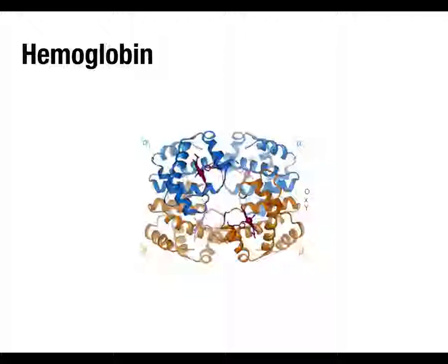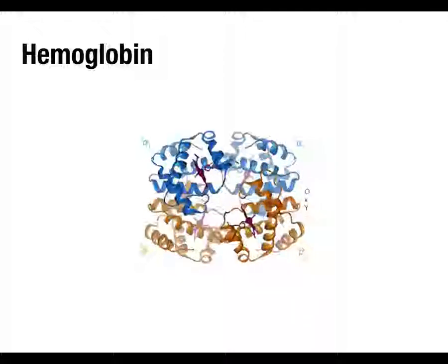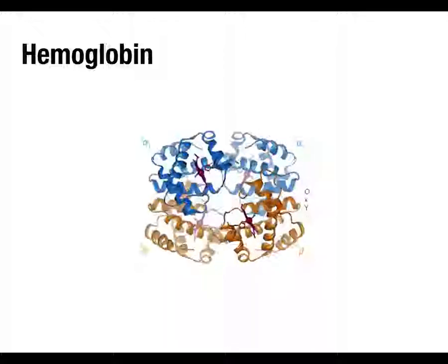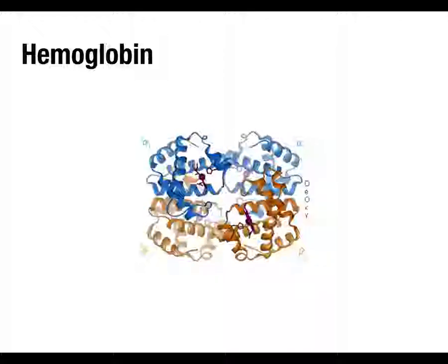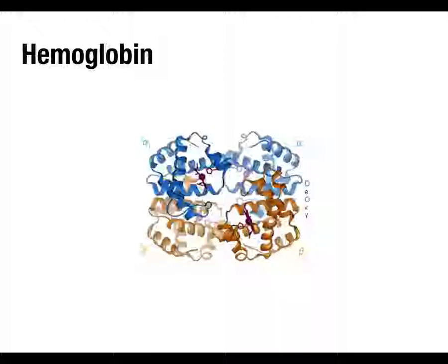And what that means in your body is that where you have concentrations of deoxyhemoglobin, you actually have localized disruptions in the magnetic field. So if you think about last time, everything in MRI is based on knowing the Larmor frequency of the tissue that you're trying to image.